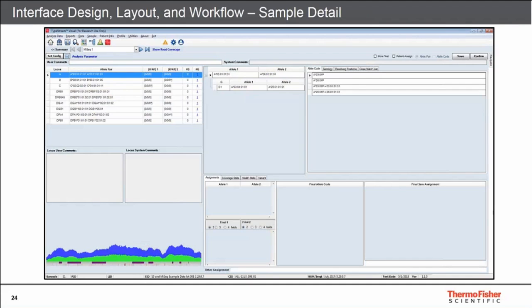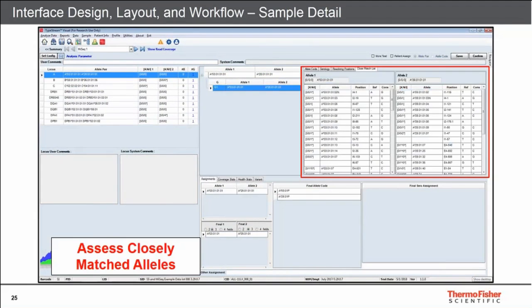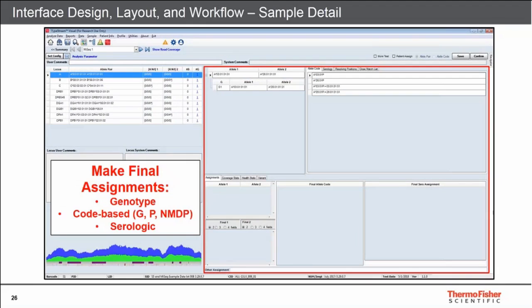The sample detail screen allows the user to dive deeper. One key feature is the close match list, which allows comparison of software-assigned results to the next set of closest matches — similar to functionality seen in Sanger sequencing and other molecular typing methods. Another main functionality is the ability for the user to make final assignments, whether genotypic, code-based (G-group, P-group, NMDP codes), or serologic assignments.